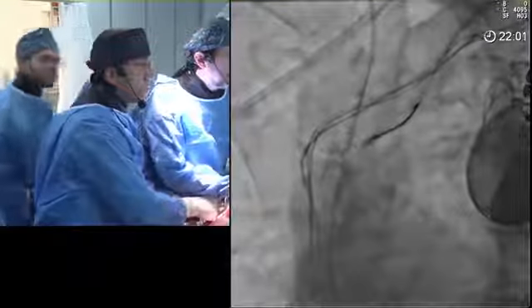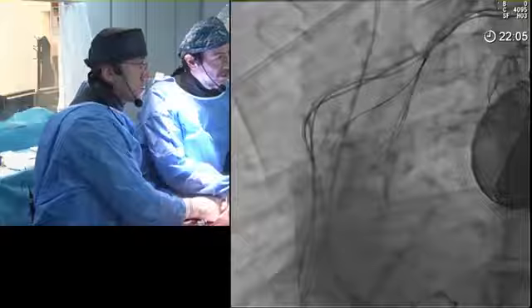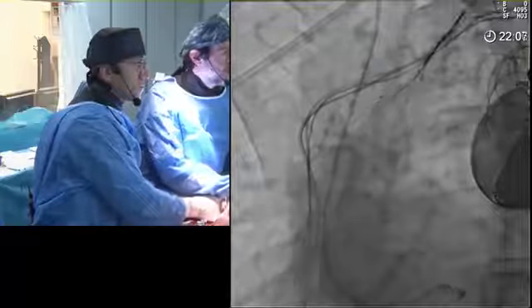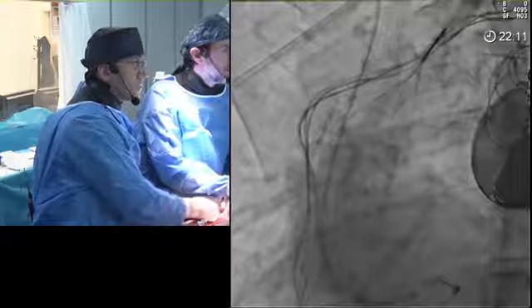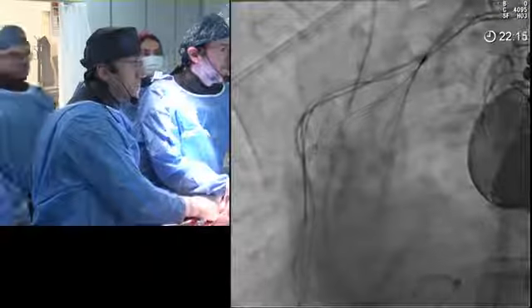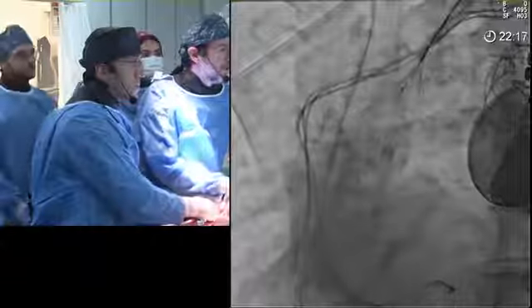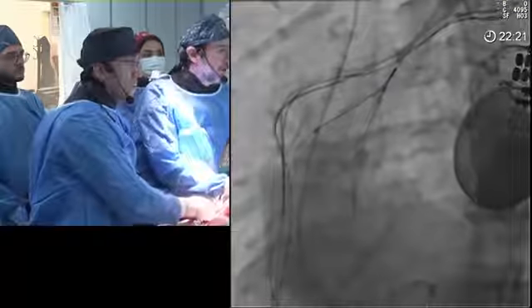Şevket, why the catheter stays still in place? The exit site is maybe different than the ostium a little bit. Al geriye, tekrar deneyelim.